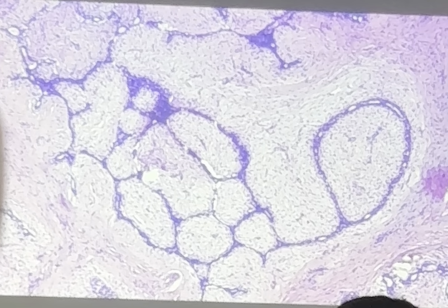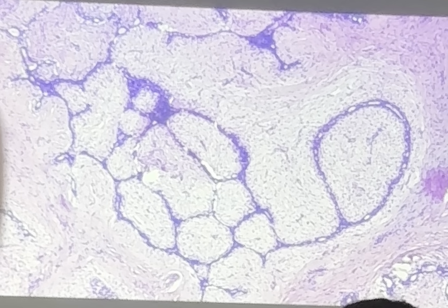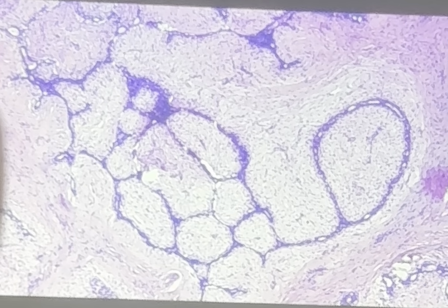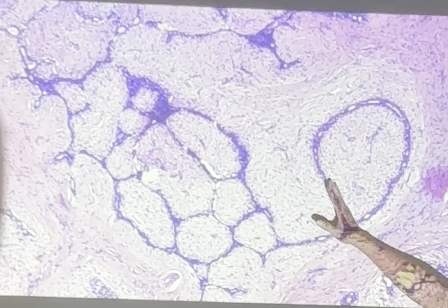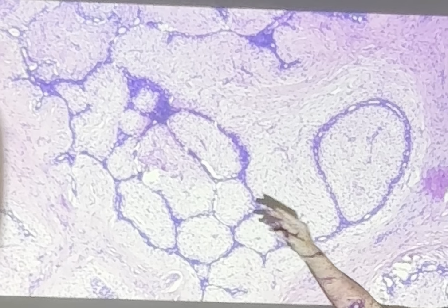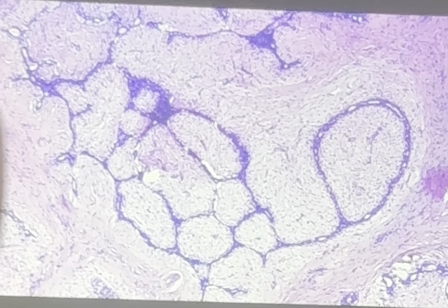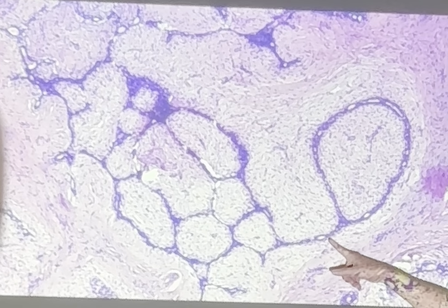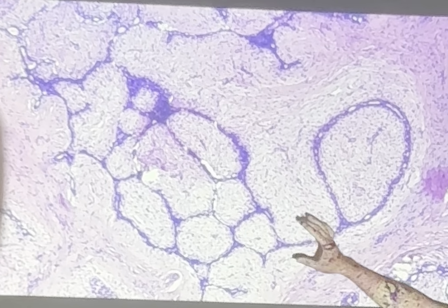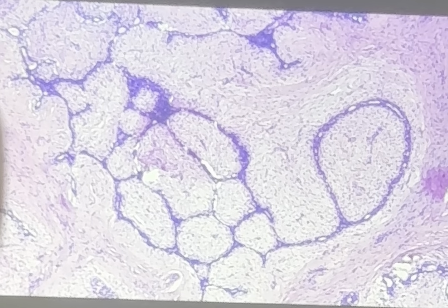This is a tumor not of the epithelium, but of the stroma, of the fibroblasts surrounding the terminal acini and ducts. So the stroma is proliferating. And because it's proliferating, it's compressing your mammary ducts and your mammary acini to form this flattened-like appearance. So all of your breast glands have been squished because of the proliferating stroma. So this is a benign neoplasm, and it's called fibroadenoma.